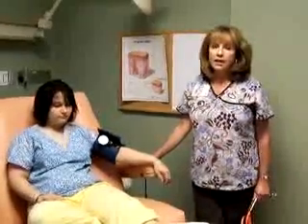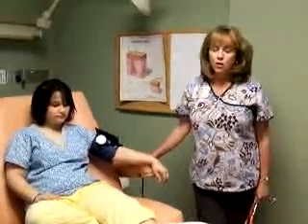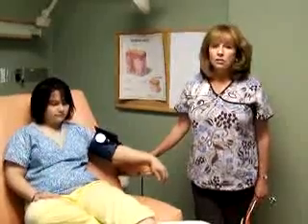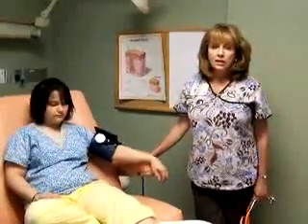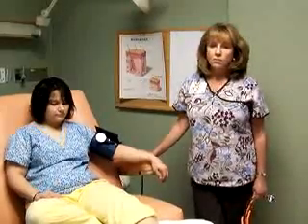The setting today is an outpatient wound clinic, so part of our normal new patient workup for patients with lower extremity wounds is to do an ankle-brachial index. So today we're going to demonstrate the process of obtaining that.